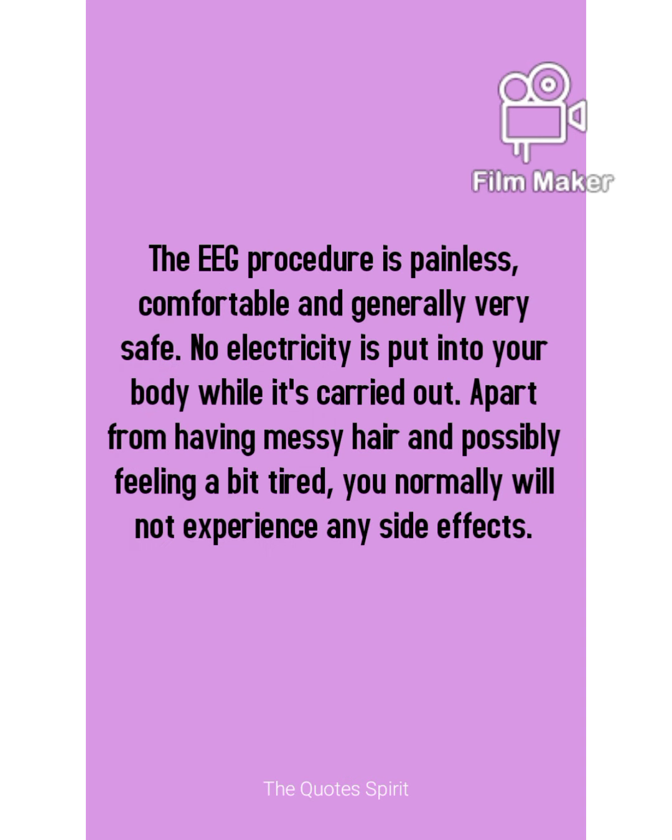Many people say that they are not going to do the EEG test whenever they have any kind of psychological problem or disorder. They fear that the EEG test may cause them pain or something. But the EEG procedure is painless, comfortable, and generally very safe. No electricity is put into your body or inside your brain when the test is being carried out.